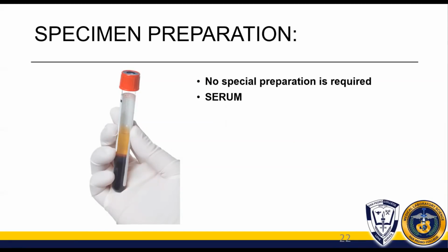And likewise, class, limited lang din kasi ang anticoagulant na compatible with serologic testing. Pinaka-compatible is heparin, green top. But heparinized tubes are pricey. So, di siya cost-effective for the laboratory. Lalo pa kung limited ang budget ng laboratory. So, it is always safe to use serum kasi pwede lang naman plain red top tube ang gagamitin natin. But you can also use gel separator tubes class ha, so long as serum ang liquid portion ng ating ma-isolate or ma-extract from the blood sample.